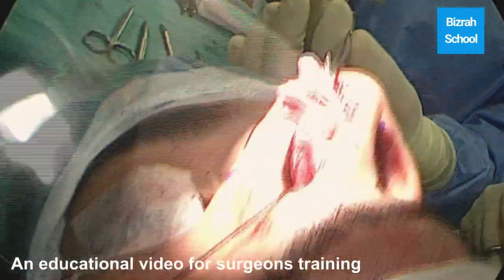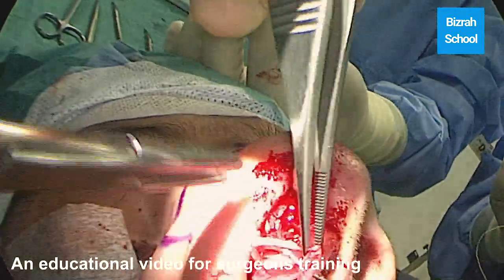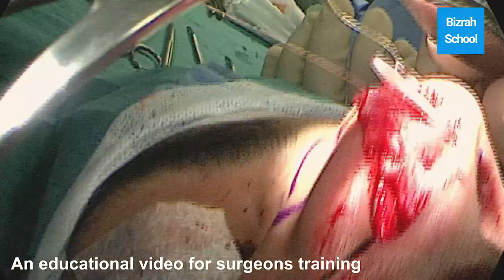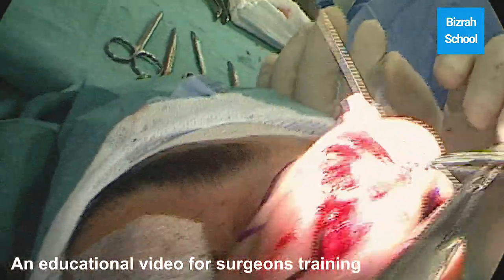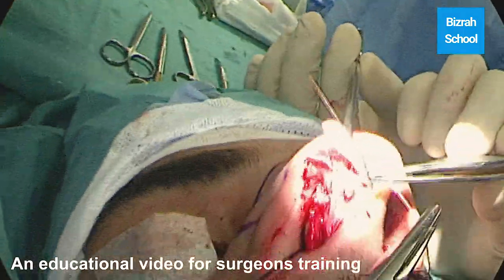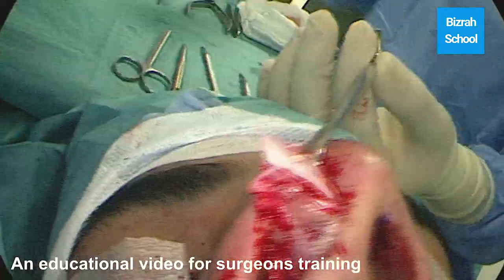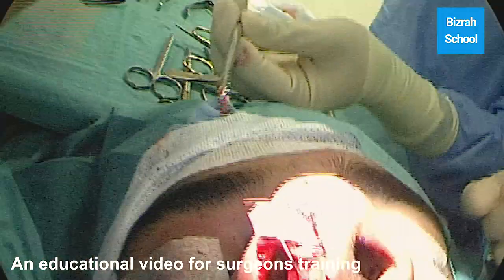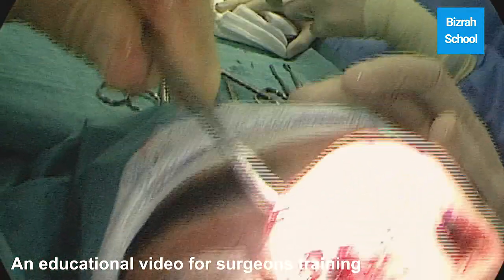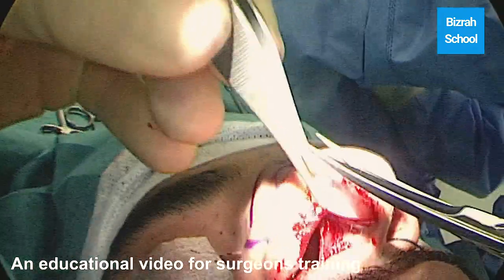This compensates for the loss of tip support caused by our incisions and excisions. It's an excellent technique — straightforward, achieve your goals. Your goals are to achieve adequate tip support, to achieve a balanced nose, to achieve a symmetrical nose with patent airway. That's what we are doing. In a short time — in less than 45 minutes, sometimes in 30 minutes — depending on the situation. But most of our cases it takes about 30 minutes only.